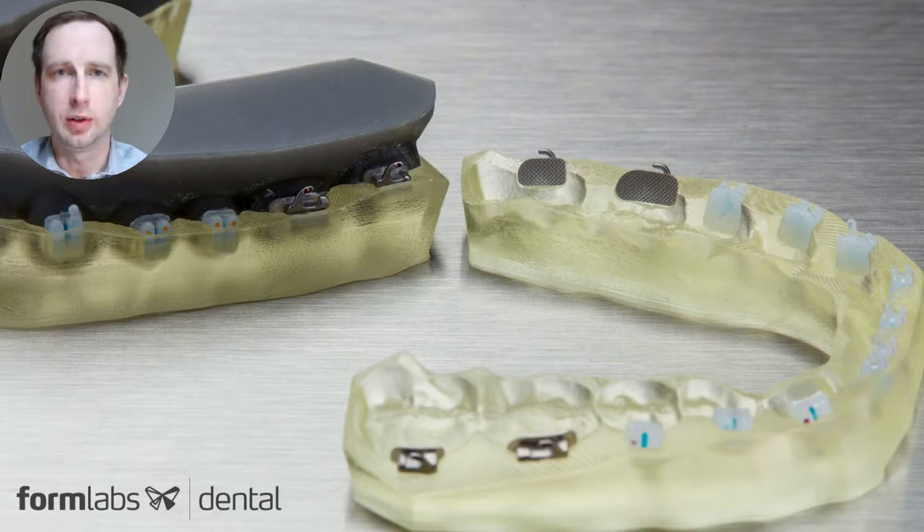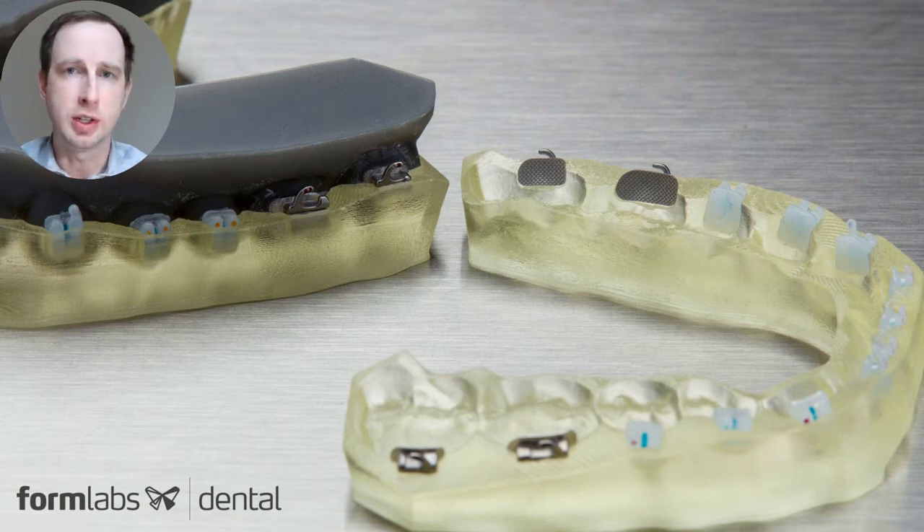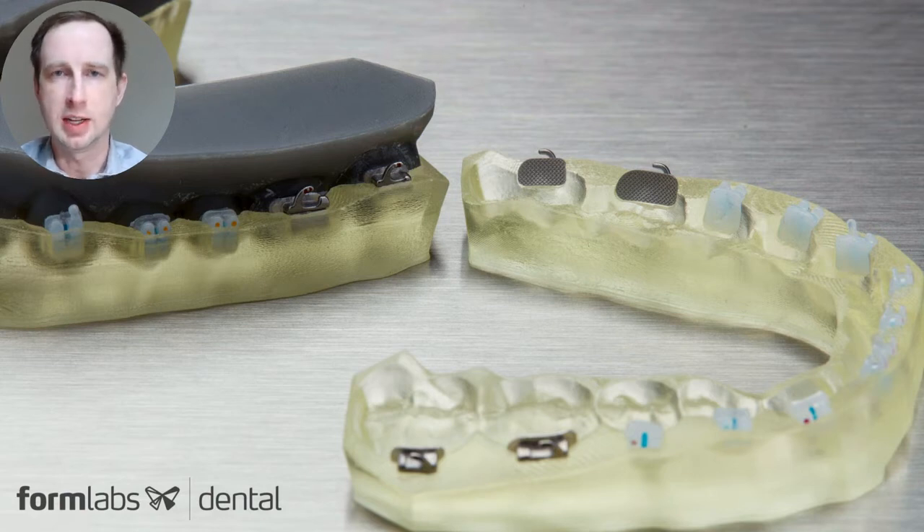The way we are able to achieve the accuracy, consistency, and material properties needed for indirect bonding trays was due to the fact that we have material scientists, product managers, and manufacturing teams all working together under Formlabs. This enables us unbelievable flexibility in taking market feedback or direction where needed, and tuning or tweaking wherever we need, either in print settings, how the materials perform, flex, rip away, and also testing and tuning for biocompatibility.